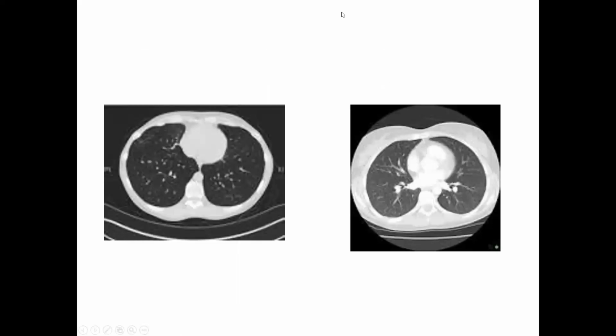Looking at the CT, CTs are pretty cool to get the opportunity while you're in clinical to go and see a CT be done. One cool thing about a CT is that, and I'm terrible at drawing, so bear with me, if you're looking at a patient, and I'm going to draw a stick figure patient lying in supine position, supine meaning they're facing up, so they look up.